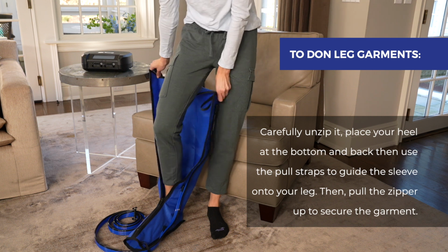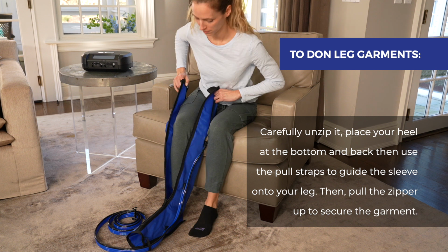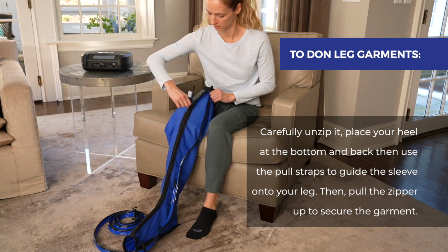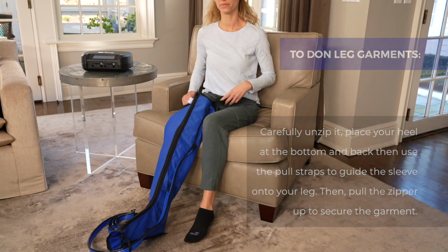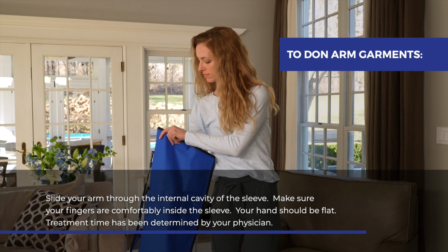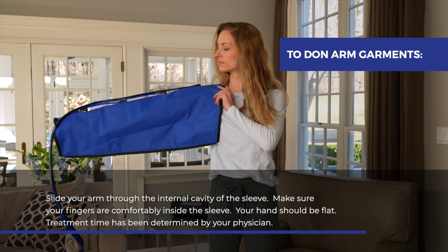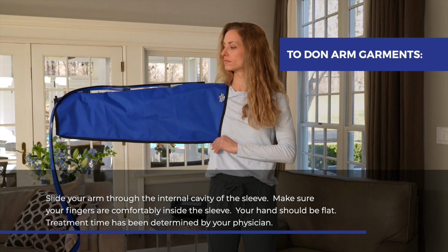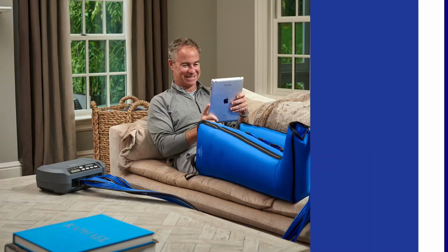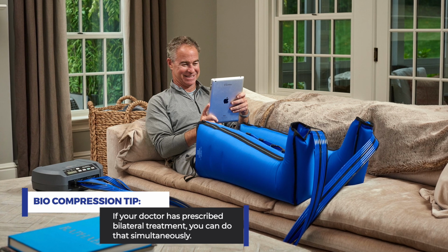To don leg garments, carefully unzip it. Place your heel at the bottom and back and use the pull-up straps to guide the sleeve onto your leg. Then pull the zipper up to secure the garment. To don arm garments, slide your arm through the internal cavity of the sleeve. Make sure that your fingers are comfortably inside the sleeve. Your hand should be flat. Treatment time has been determined by your physician, and remember, if your doctor has prescribed bilateral treatment, you can do that simultaneously.